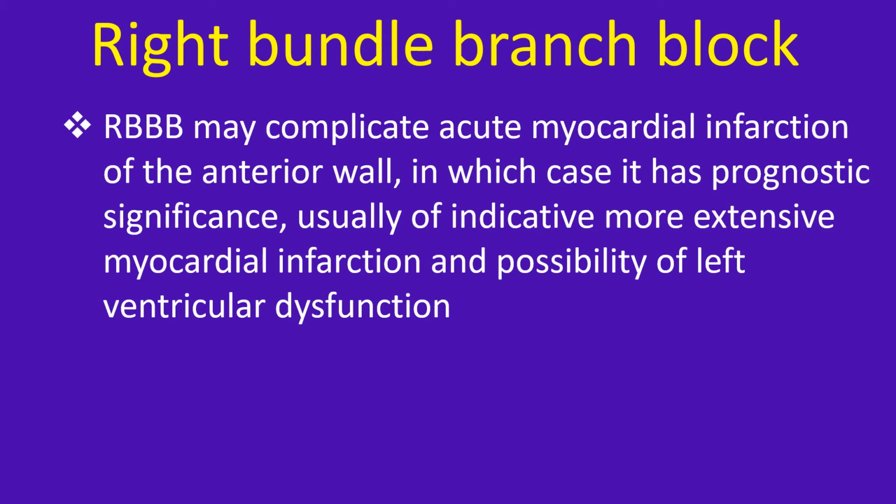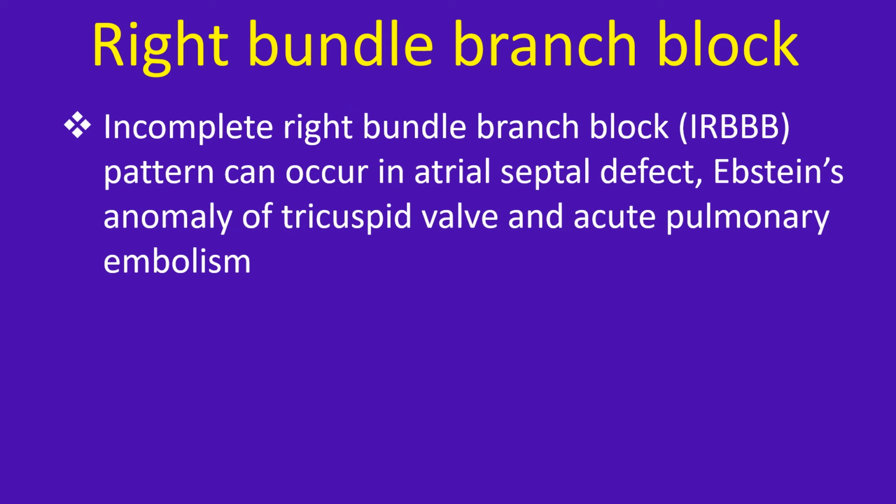indicative of more extensive myocardial infarction and possibility of left ventricular dysfunction. Incomplete right bundle branch block pattern can occur in atrial septal defect, Ebstein's anomaly of the tricuspid valve, and acute pulmonary embolism.